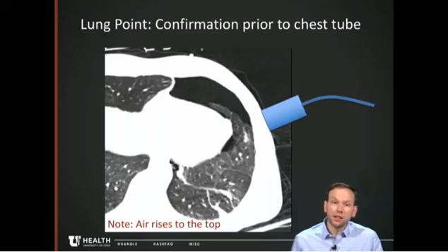And that as the lung inflates and deflates, that point is going to move up and down. And so you'll actually see on the ultrasound beam a distinct interface between lung going up and sliding against the chest wall and the absence of lung, which is air. This also shows why we need to look at the non-dependent portion of the lung, because if you looked for your pneumothorax in the back of the lung, in the posterior position, you would see normal lung sliding, and you would be falsely ruling out the pneumothorax.